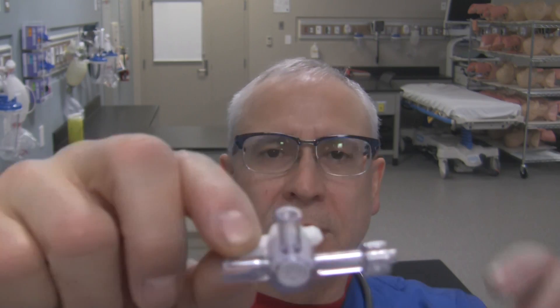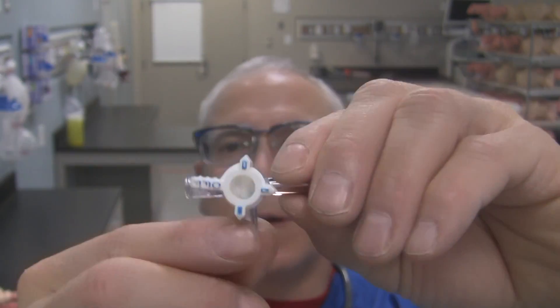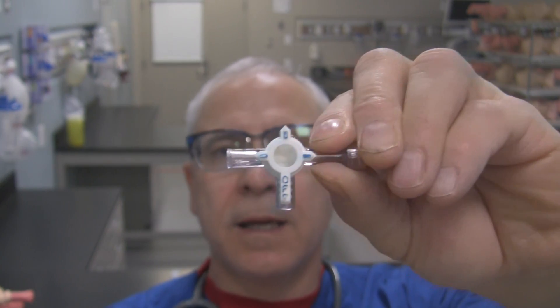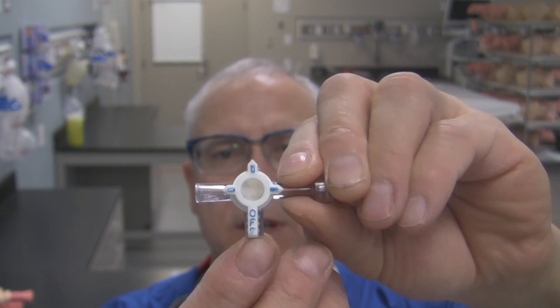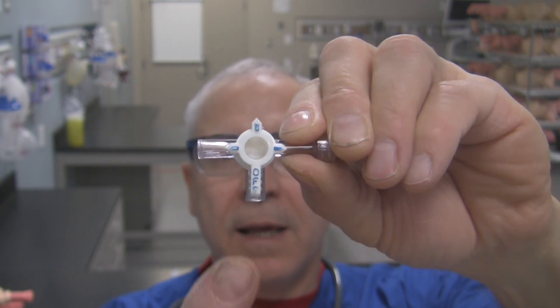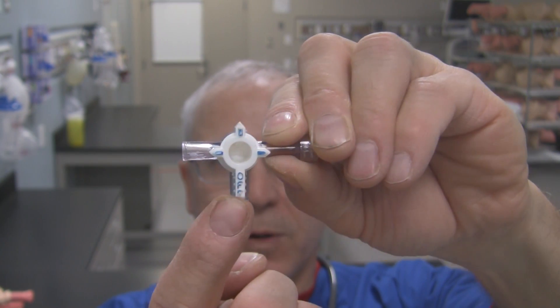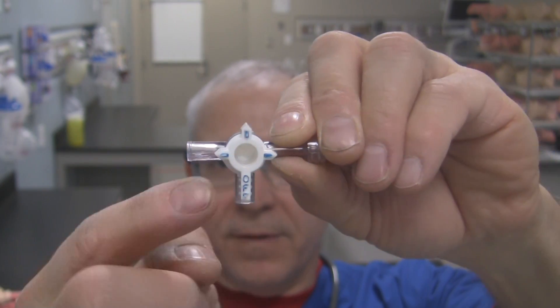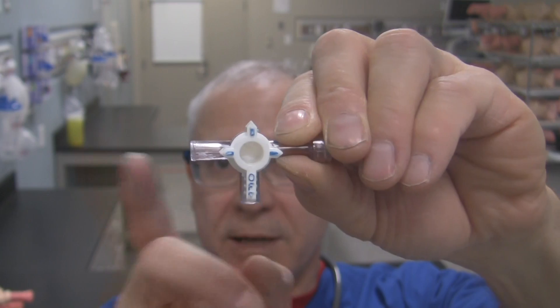So how do we know what's communicating with each? If we turn this around, you can kind of see — I'll put this down so it's easier to see — this tab here that we use to control the stopcock with says 'off.' Whatever port that points to, that means that port is shut off or isolated from all the other ports.